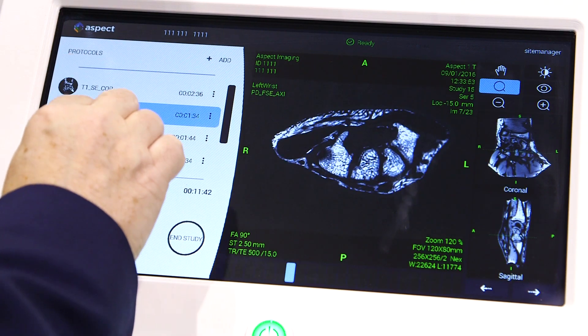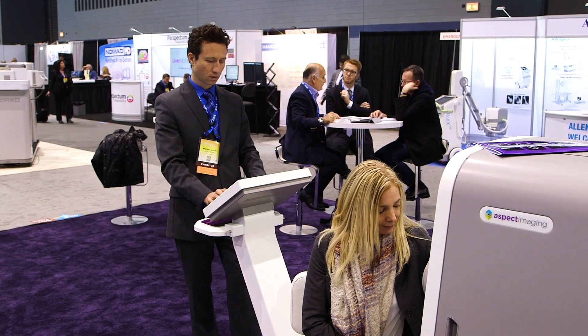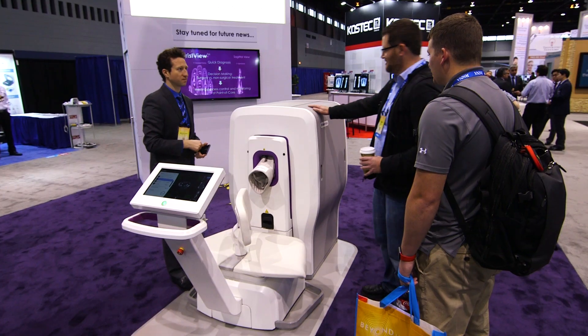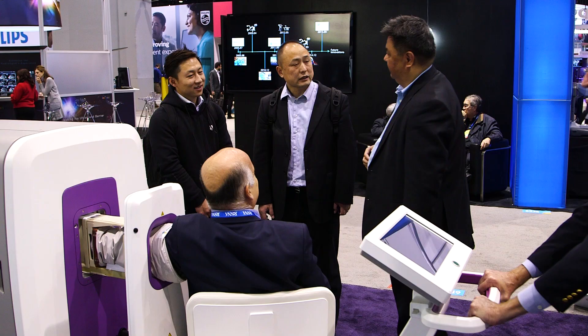The system is extremely quiet and very simple to operate. We have a very simple, intuitive user interface. Based on permanent magnet technology, this system requires virtually no maintenance, so it has very low running costs.